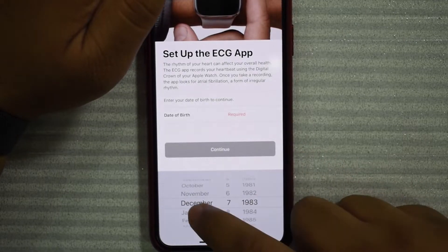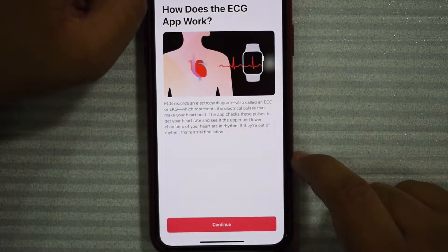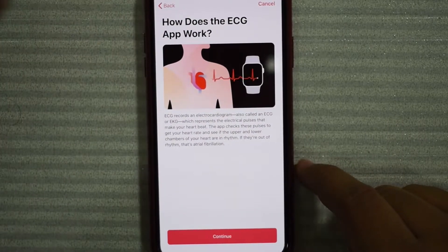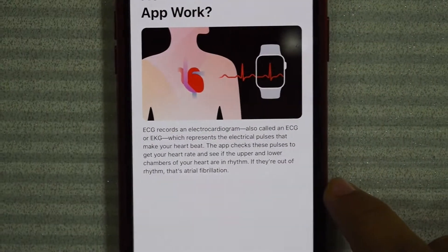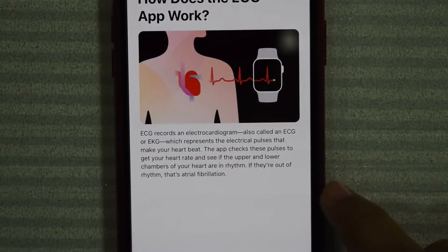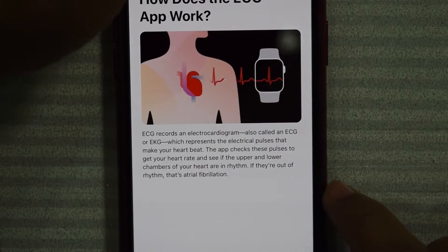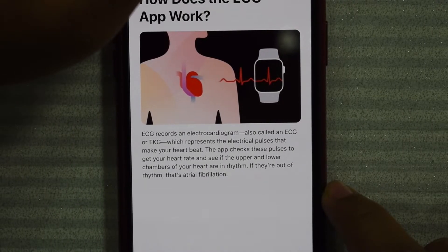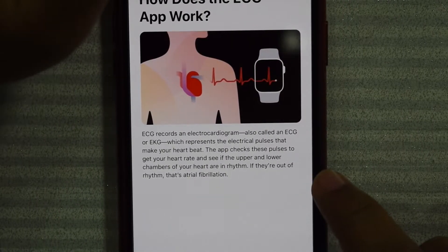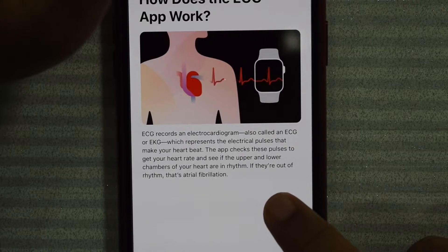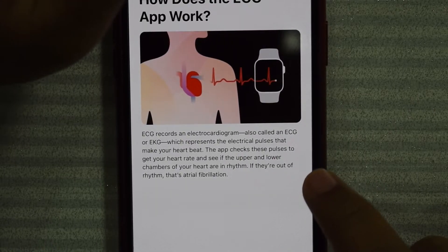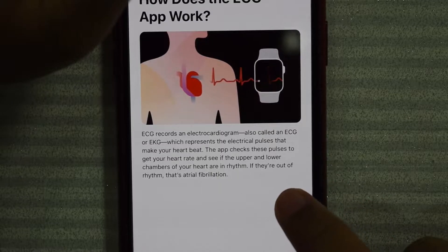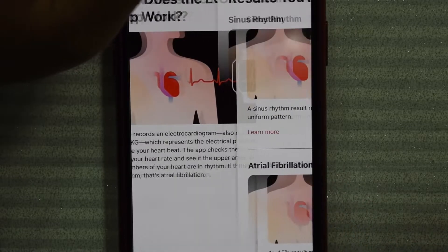It asks for your date of birth. Here we go. It's giving you kind of an introduction of what an ECG is and how it works. ECG records an electrocardiogram. The app checks these pulses to get your heart rate and see if the upper and lower chambers of your heart are in rhythm. If they're out of rhythm, that's atrial fibrillation. Continue.